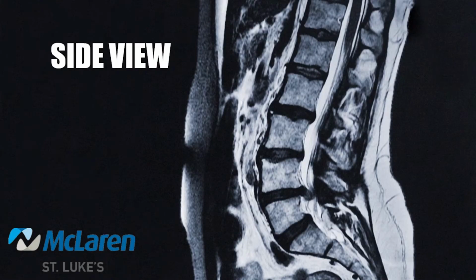So if we come back to the next image from the side view, what I would actually do at surgery is I would trim this portion of the disc off, and by doing that, that would unpinch the nerve and help with your symptoms. So this may be representative of an MRI that you saw in the office, which represents a herniated disc.